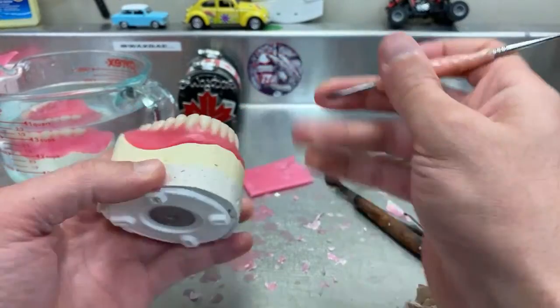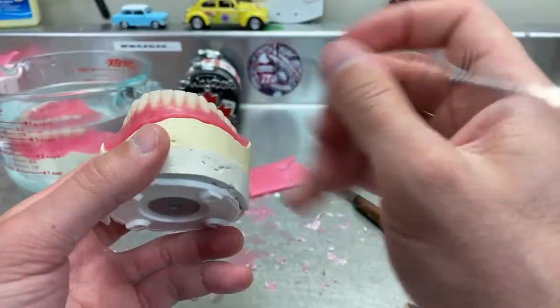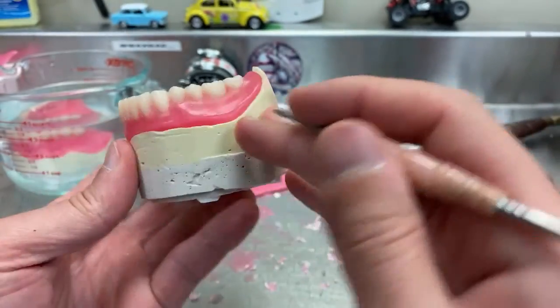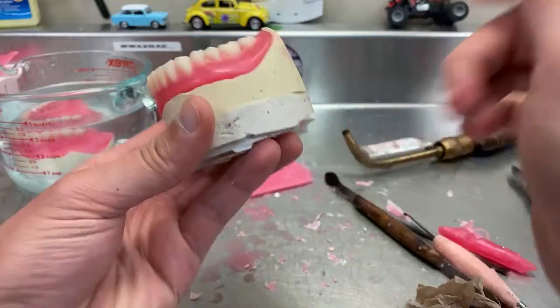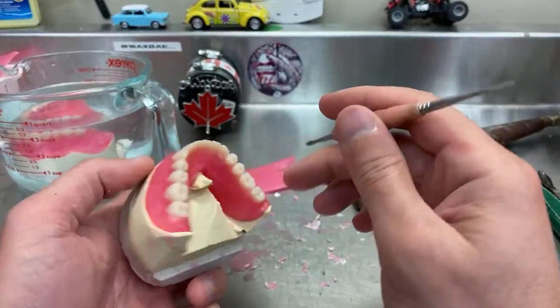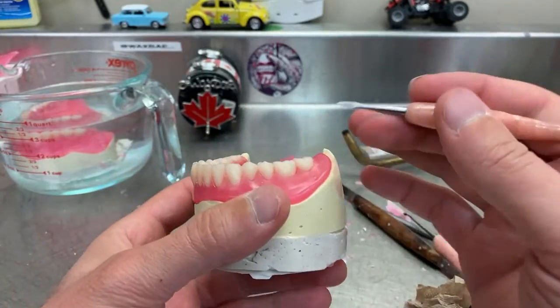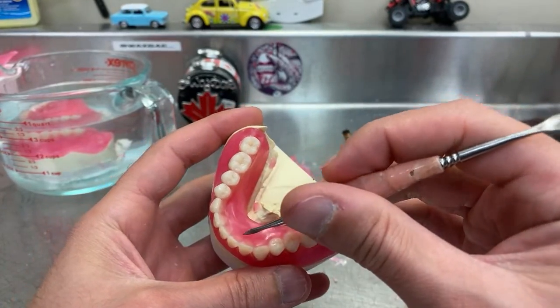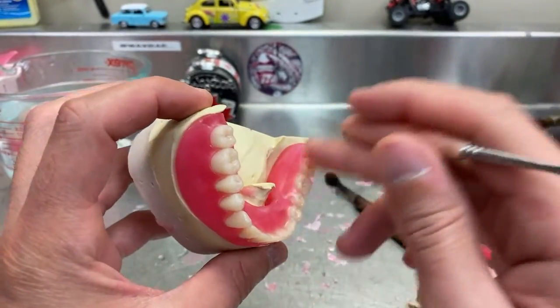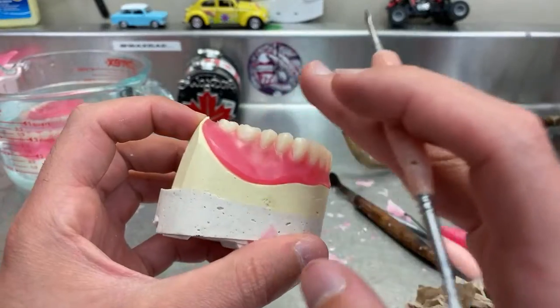Not much to explain here, straightforward. Carving 101. What you need to do is carve those and then a little lower on the canines and then all similar on the sides, depending on how you're carving, as I said, based on aesthetics. Because this is a try-in, I'm not going to be carving the insides. I'm just going to leave it as it is so I don't get saliva traps in here, and then when I come to adjust it or work on it, you'll get all those nasty things stuck in there when you're heating it. Smells really bad too. So just keep it on the outside.